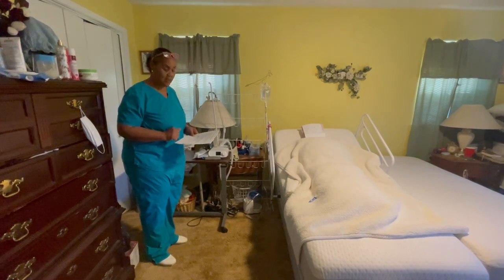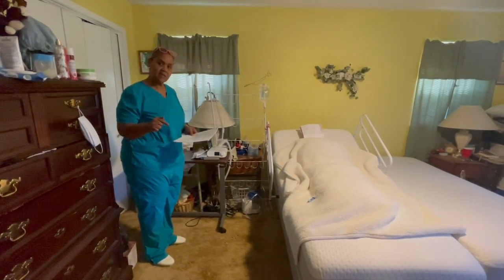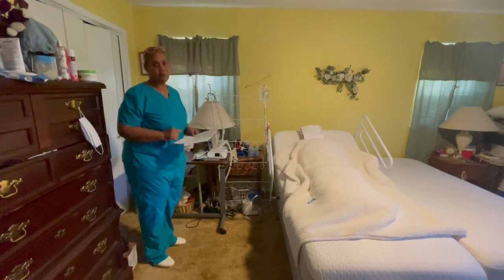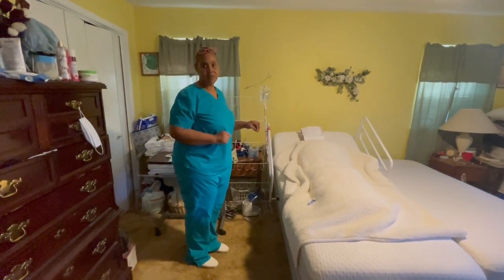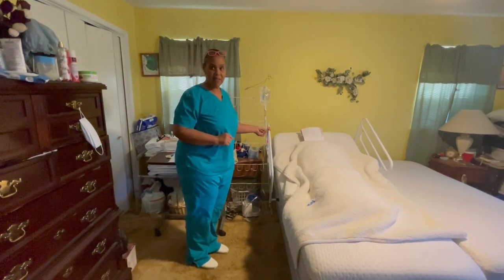So just to put that in, it's going to be 100 mils times the drop factor of 10 divided by the time of 30 minutes, which is going to make 33.3 GTTs per minute. I'm rounding that to 33 GTTs per minute. I must say that the pump is going to ask you for your volume and it's going to ask you for your rate. That is what I'm going to put into my pump today.